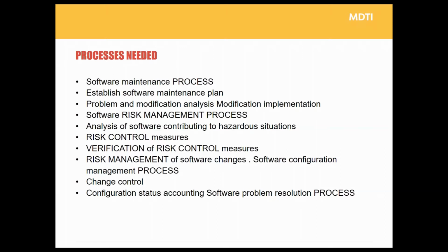Risk management, as a central process, is impossible to apply after you've already built the software. It's a design input. It will dictate elements of your software architecture and your module structure. So make sure risk management is part of your product planning process. Depending on the complexity and the risk profile of your device, you're going to have some level of software configuration management, so you can keep track of the build levels and the releases of the software to your users. And if you've got all that, you're doing pretty well at this time.